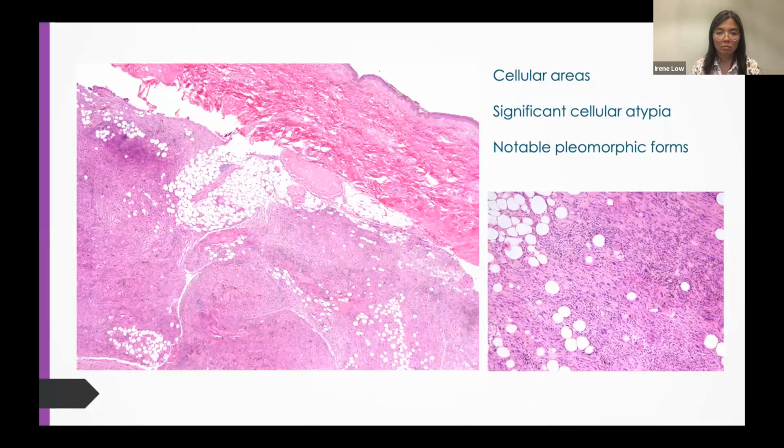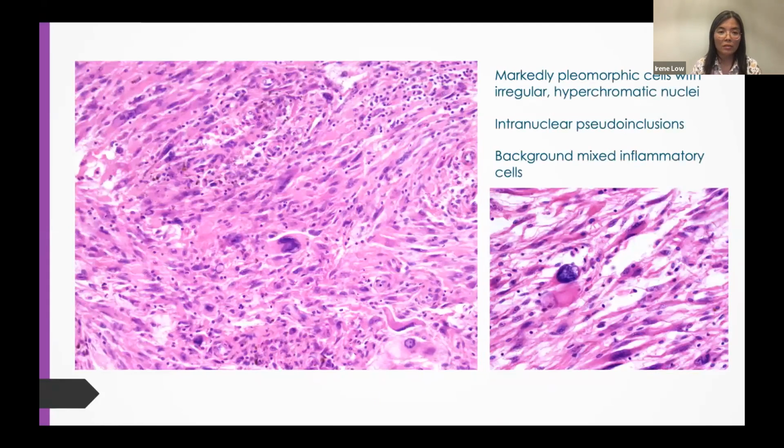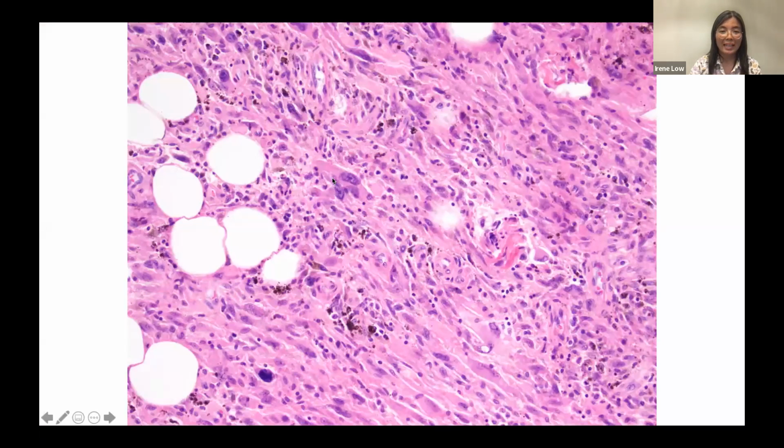In some areas, however, in the subsequent resection following the diagnosis made on the initial core biopsy, the resected specimen had much more cellular areas in which we noted significant cellular atypia with quite pleomorphic cells. There were indeed mitoses to be found, up to 4 per 10 high power fields, without necrosis. You hopefully would agree that there are some rather spectacularly pleomorphic cells scattered throughout the tumor, with a sprinkling of background inflammatory cells and a few areas of hemosiderin deposition. And just one more higher power, to impress upon you the atypia that's seen. There's a suggestion that some of the cells are rather more plump and epithelioid, with multinucleated forms and rather large nucleoli. Fairly prominent throughout the tumor, we also see tumor cells that have intranuclear pseudo-inclusions.